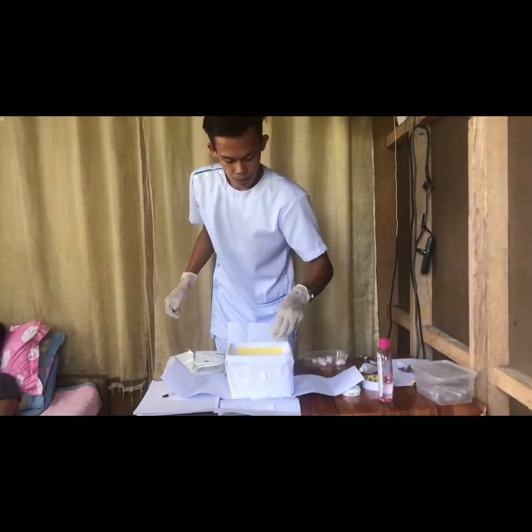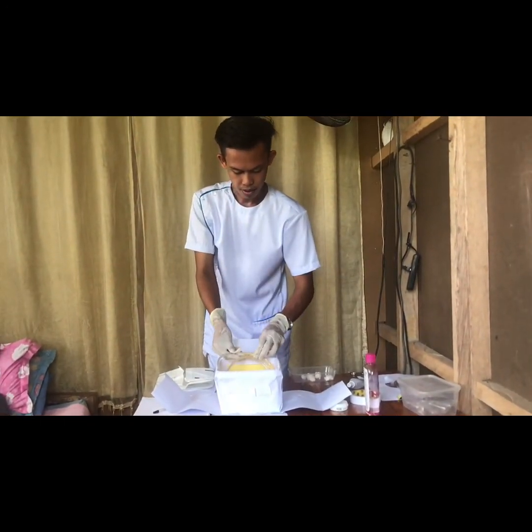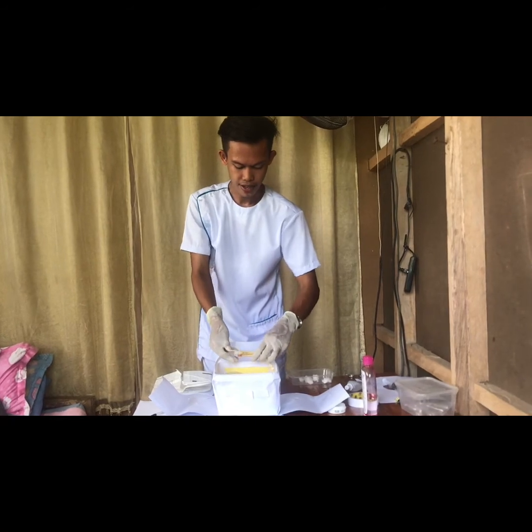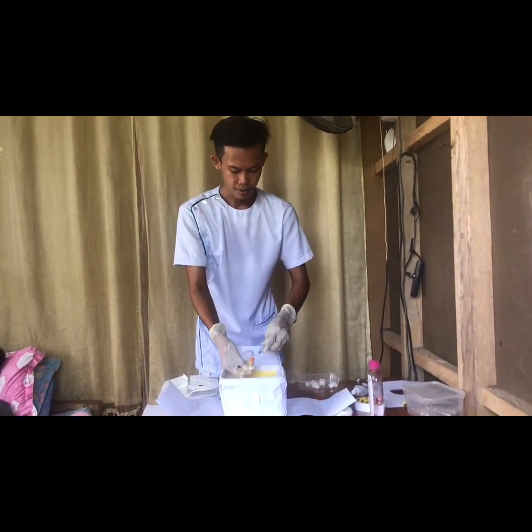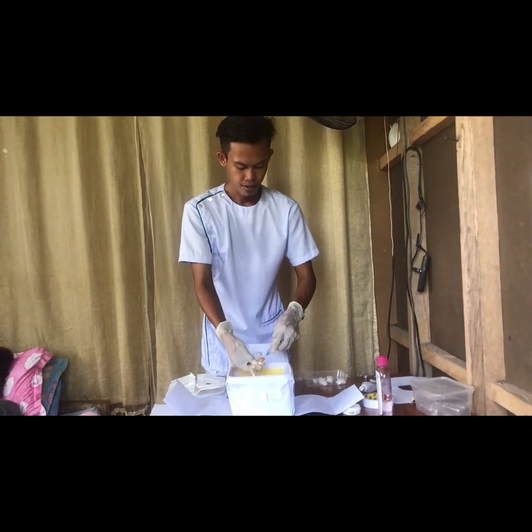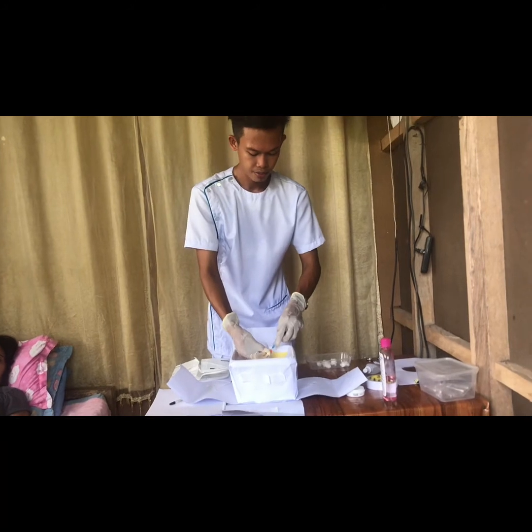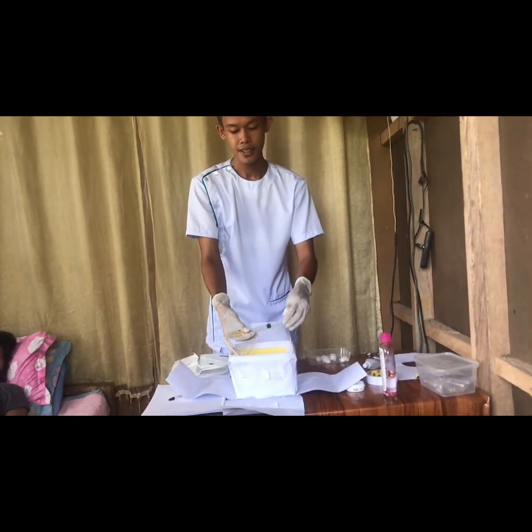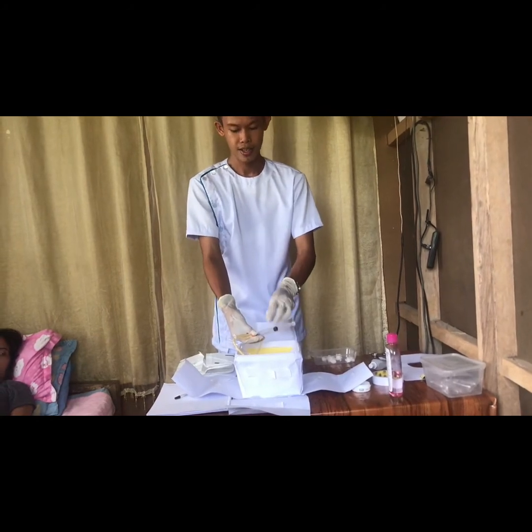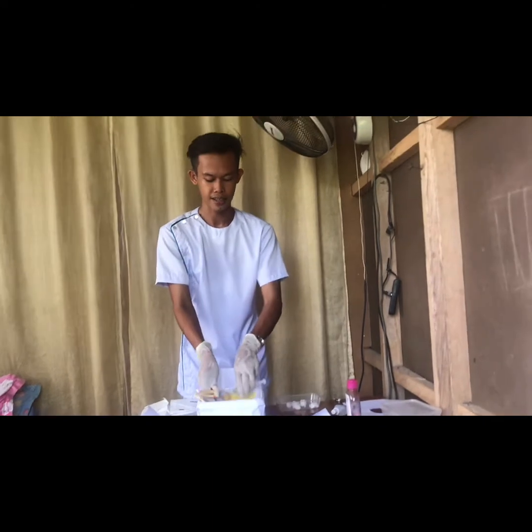And then we are now going to find the catheter size 16, and then we're going to attach it. Always remember, do not inflate. And then okay, finally the 10 cc syringe and the catheter are now connected. So I'm going to set it aside.